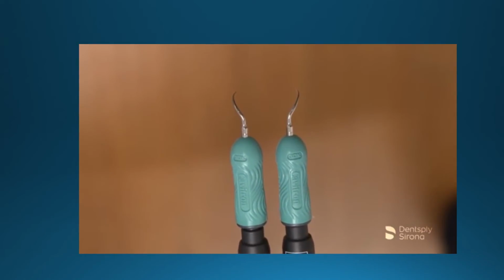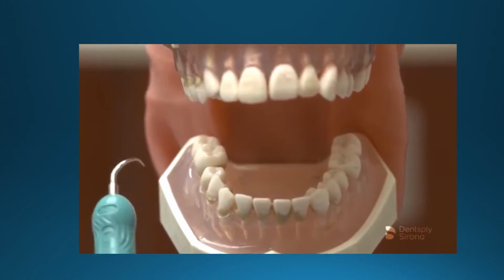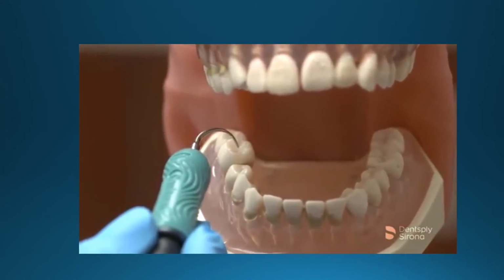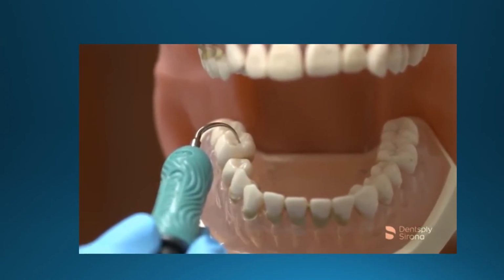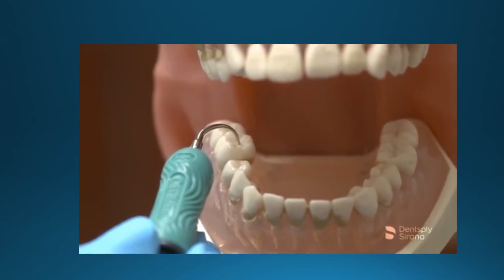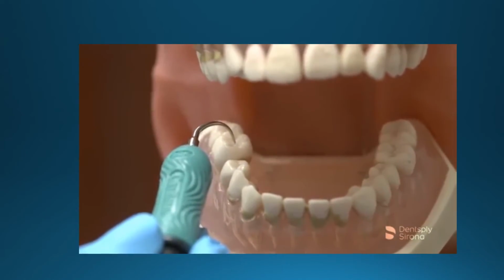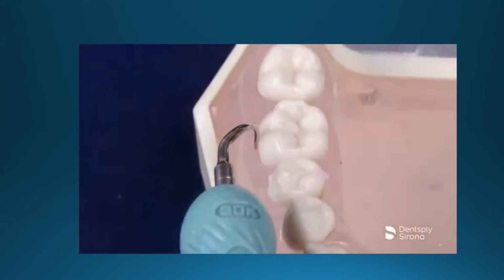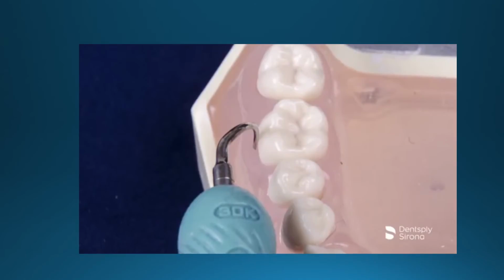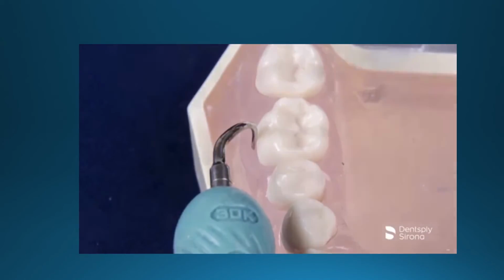The right insert will curve to the right and the left will curve to the left. It is also helpful to place the insert on the occlusal of the intended tooth, as demonstrated here, to see the curvature to ensure you selected the correct insert. After this is established, maintain a vertical approach and notice that the back of the insert is adapted to the surface you are entering. Utilization of all surfaces is indicated for proper adaptation in periodontal pockets interproximally.